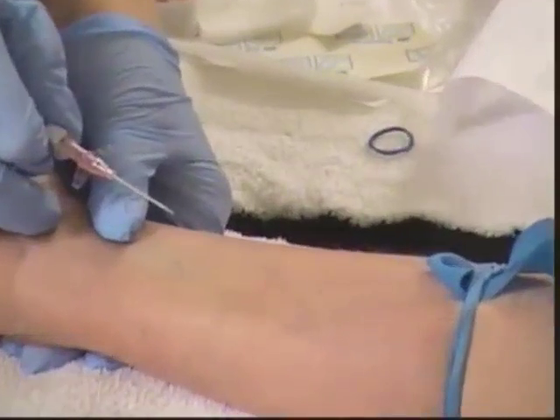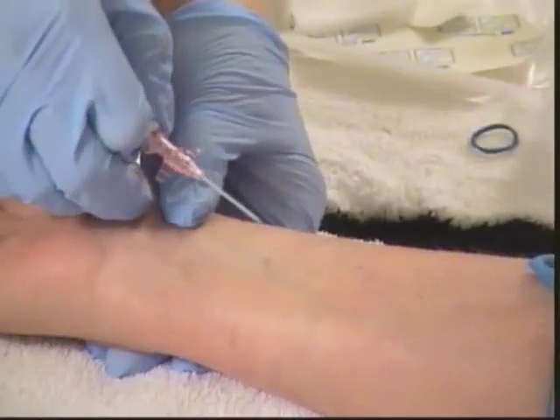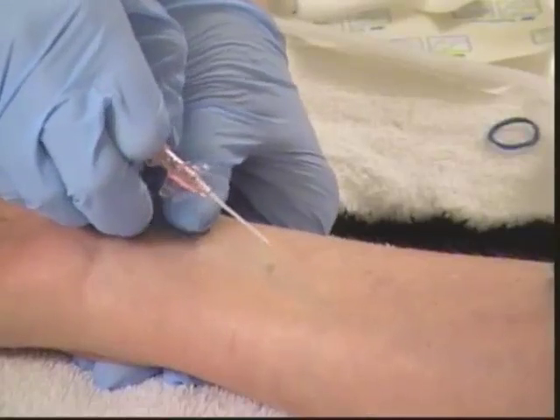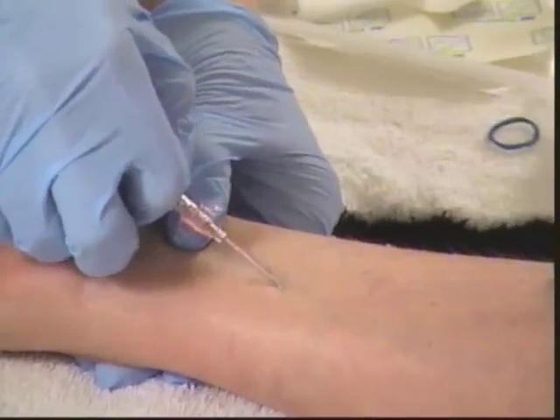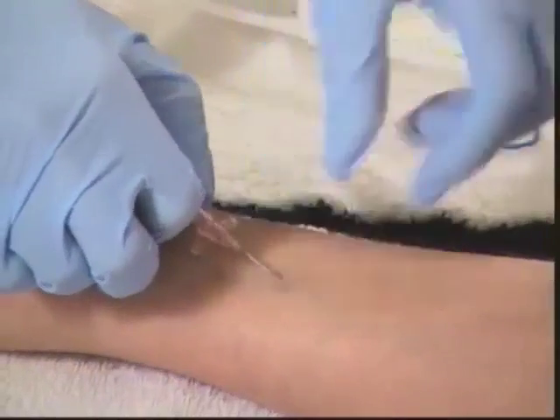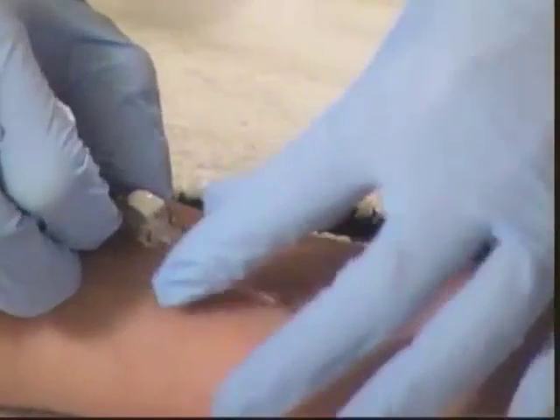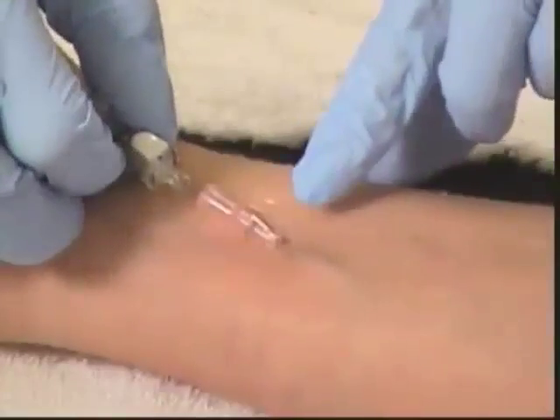At a 10 to 30 degree angle depending on how superficial the vein is, we're going to enter the vein. Remember to tell the resident: 'You're going to feel a stick now.' You can do a count of three, however you want, but do let them know before you go in. I'm entering and I've got the flashback, so I'll advance just a little bit more. Then I'll be more flush with the skin as I thread the catheter off into the vein. Try to advance it all the way to the hub.